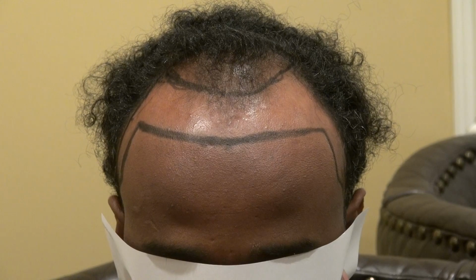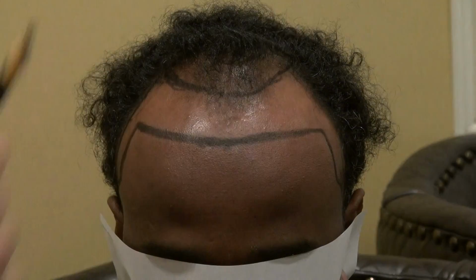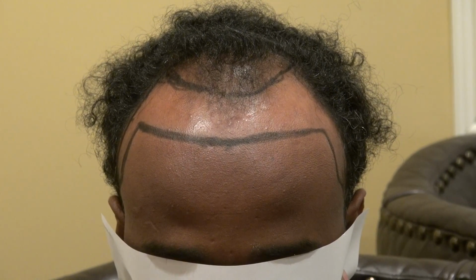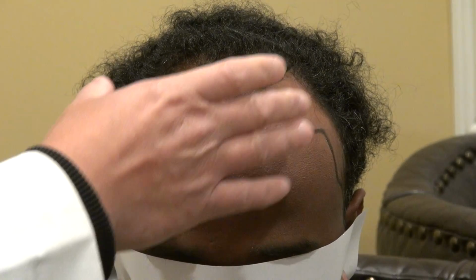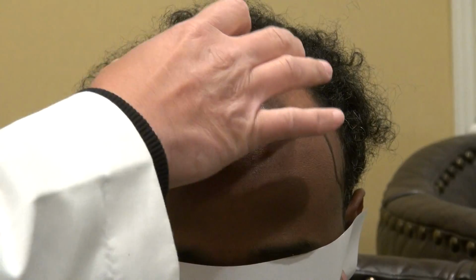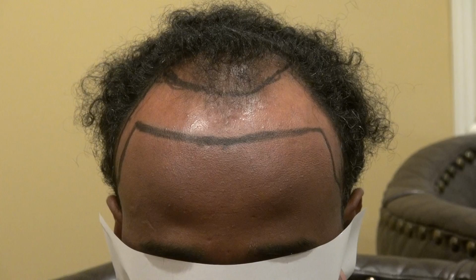For Asian and Caucasian, you start at 35, 45 in the front, it increases when you go backward, and changes when you go in a different direction. Not only is the precise angle important, the selection of hair grafts is important. We try to plant rows and rows of single hair grafts in the front, followed by two hair, three hair, and four hair grafts in the back for bulk and volume. The goal in the front is softness and naturalness. You don't want any detectability. The goal in the back is volume and density, and that's important.